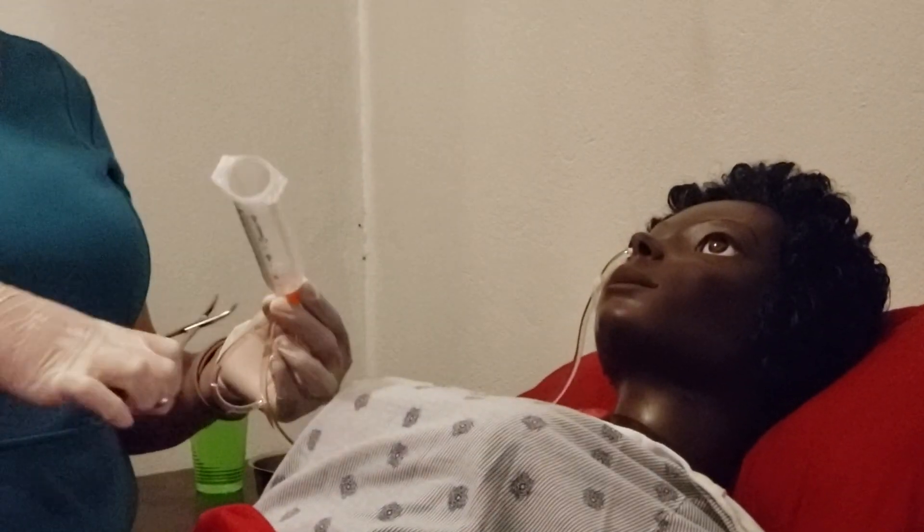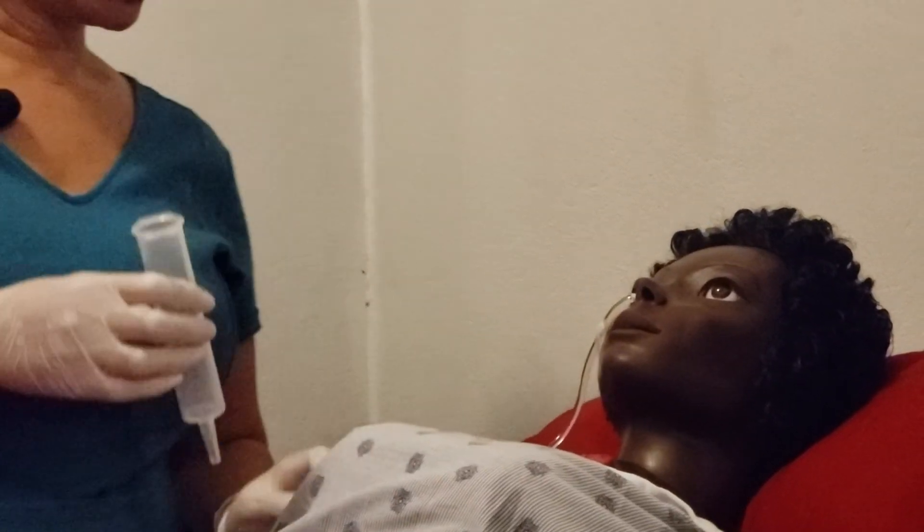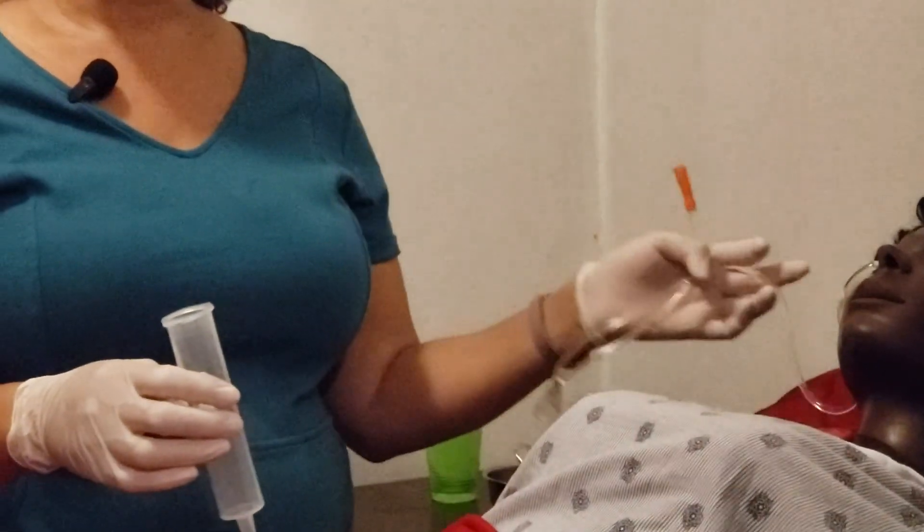Once done, clamp the tube back off and disconnect. Ensure that your patient is comfortable and that everything has gone well, then remove the draping. Dispose of equipment properly, making sure that anything to be reused is washed and attended to according to the protocol required by your facility.